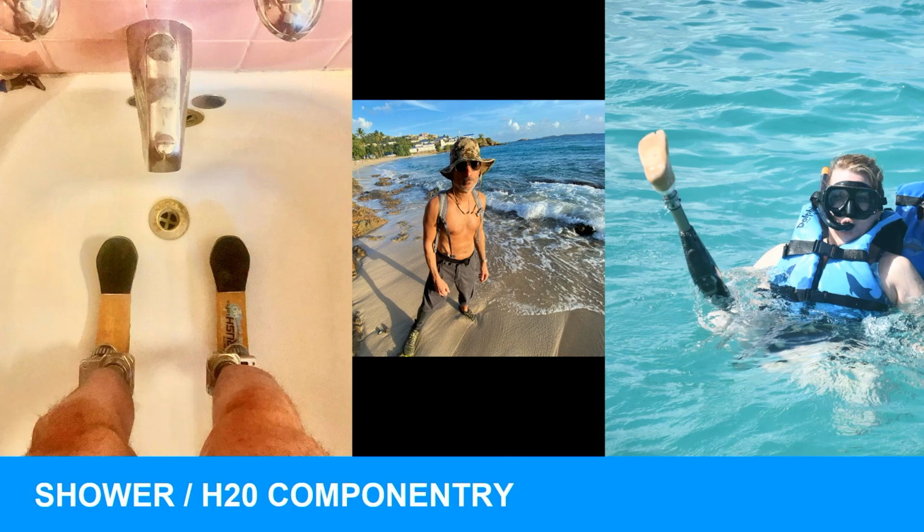Shower componentry. For the first time in my career, we were fitting shower componentry in the 80s, but we were never getting reimbursed for it, and they were basic systems. But shower componentry is now getting authorized because these patients have to wash their stoma twice a day, and we don't recommend them taking a bath because of hygienic purposes. So we're getting shower legs approved, both at the transtibial and transfemoral levels. And whatever these patients do on their spare time with those shower legs is not my responsibility. That is Nikki on the right there.